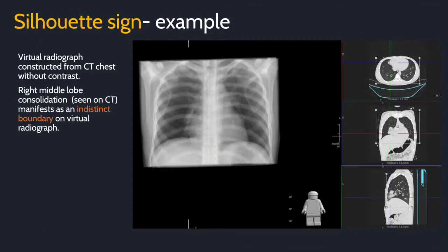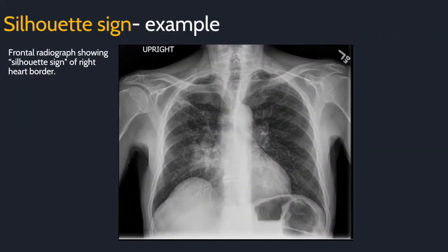To demonstrate the silhouette sign, here is a virtual radiograph reconstructed from a CT chest without contrast. On the right side of the screen, you see the three orthogonal planes of the CT with crosshairs over a right middle lobe pneumonia. Notice how this pneumonia manifests on the virtual radiograph by making indistinct the right heart border. Compare this image to the last image of a normal radiograph. Here is an example of a real radiograph showing the silhouette sign of the right heart border. Another way of saying that is a consolidation obscures the right heart border. The right heart is an anterior structure, so you can be relatively confident to say that the opacity is in the anterior right lung, in the right middle lobe, rather than the posterior lung.